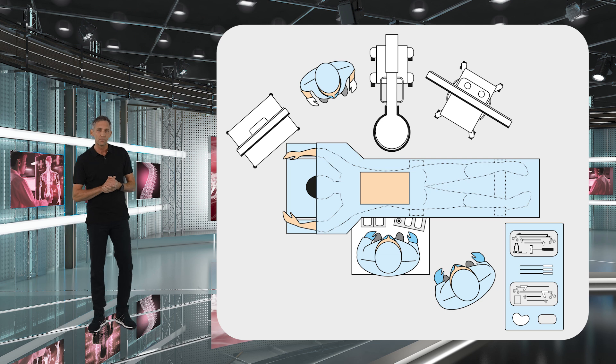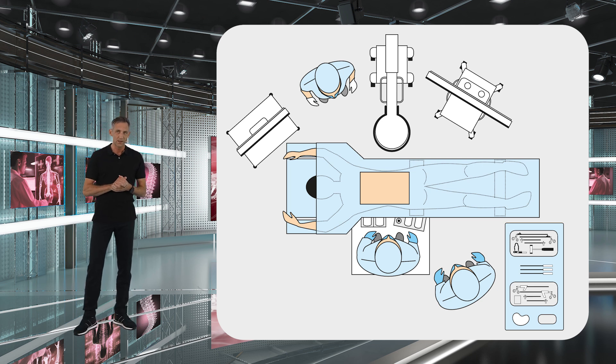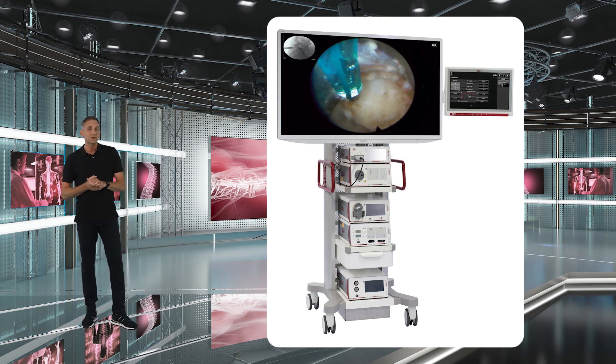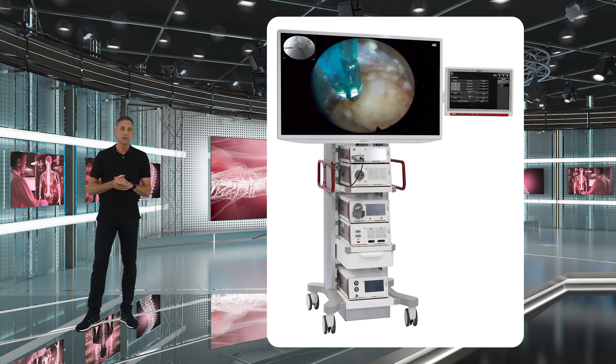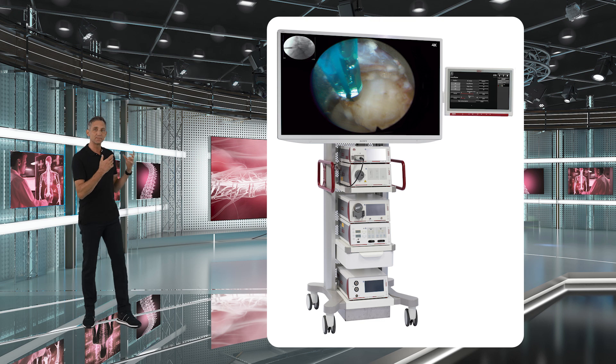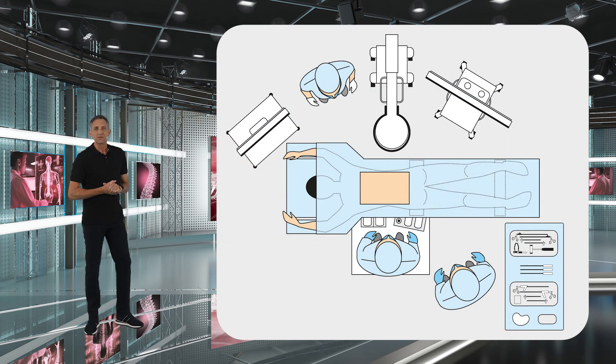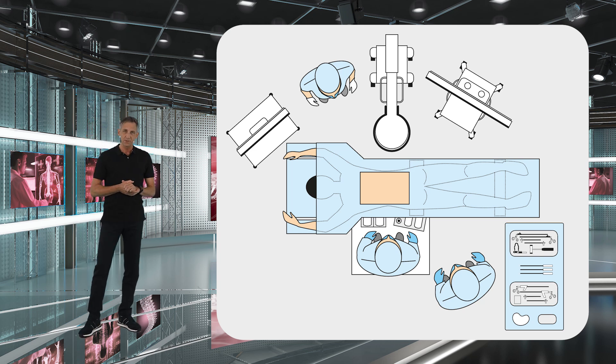You will see the endoscopic tower with all of our necessary equipment that we need — for example, the water pump. There is the bipolar and the radio frequency system, which you need for coagulation. We also have the camera system, and then there is the console for the high-speed burr and all the rest. This equipment is positioned at the far end of the patient, and this is also where the scrub nurse is positioned.